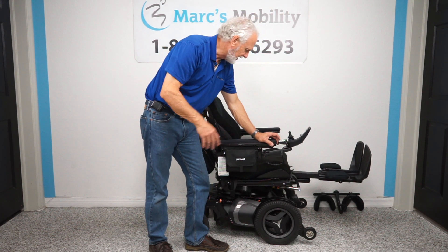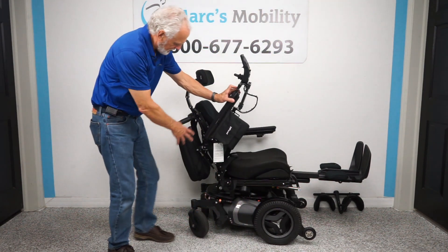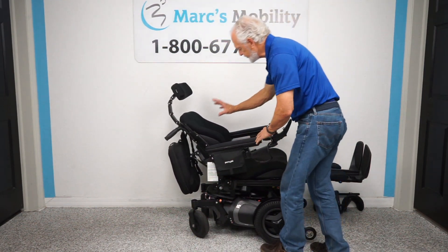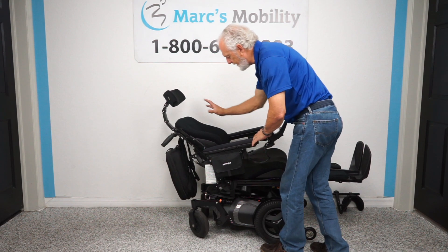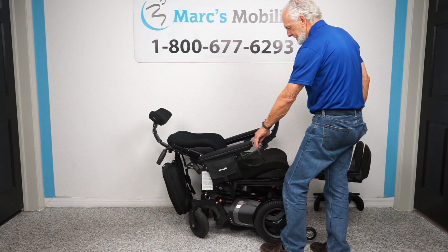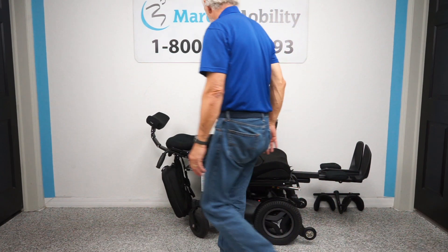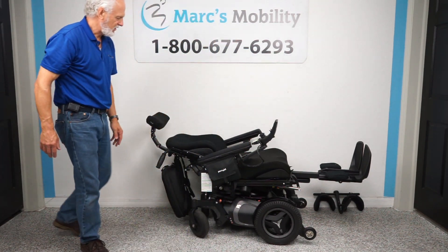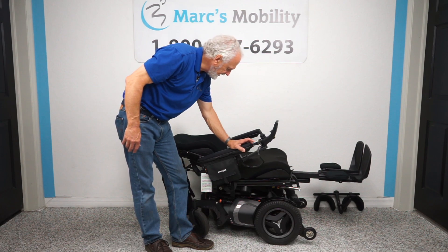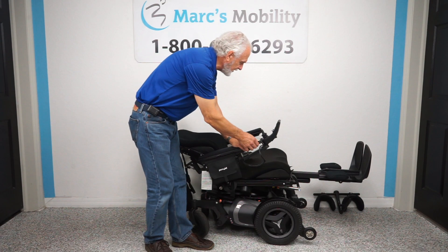Bringing the seat all the way down, we'll leave the legs up and demonstrate the recline. The recline is when just the back portion goes backward — that's the electric recline. Only this back section moves. That's the fully reclined position, essentially flat. Now we bring the back upright and the legs back down.